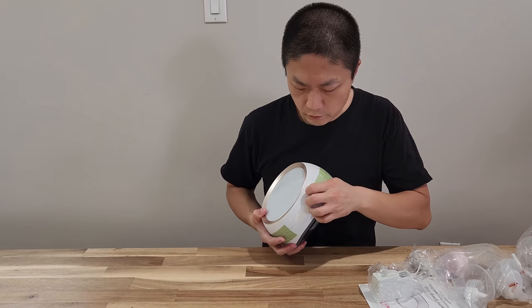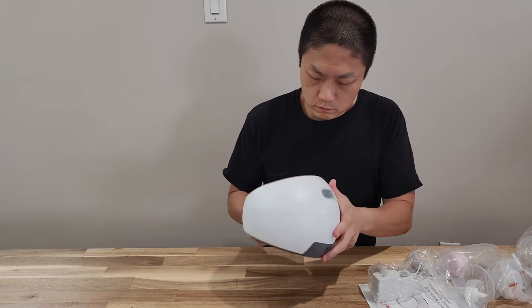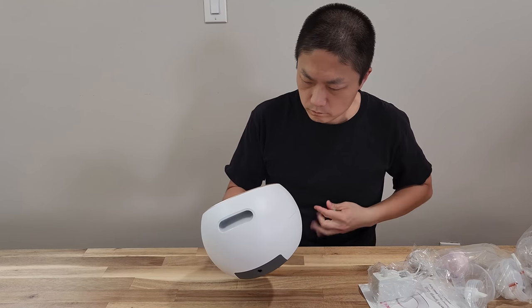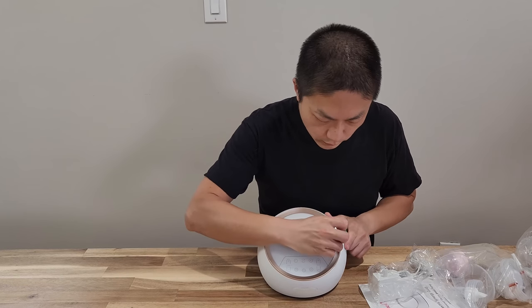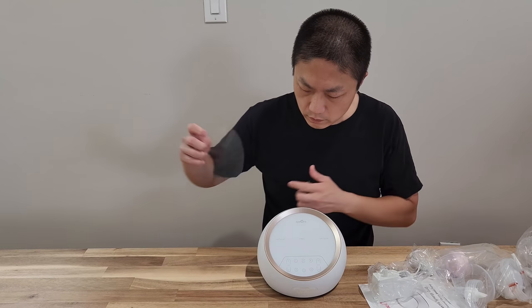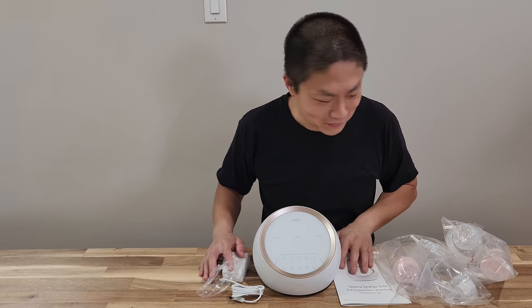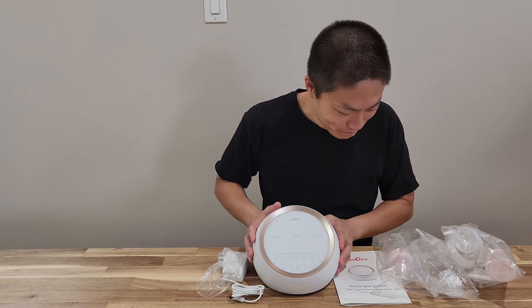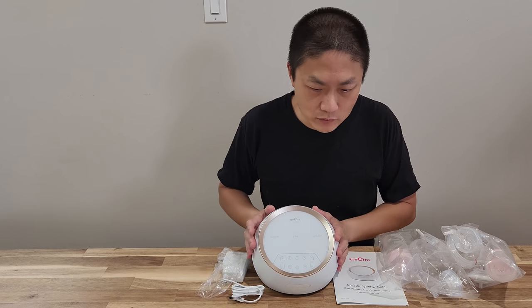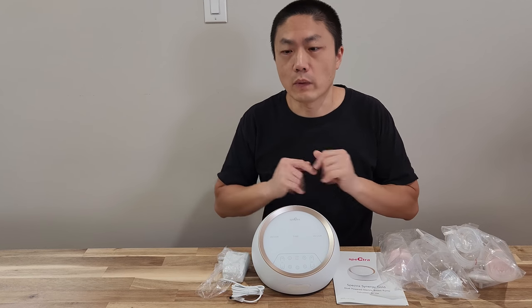It's pretty heavy. I guess this is the tape they're referring to — you need to remove it before use. There's also a layer of film on top. Usually at this point I'd say let me go try it on, but I'm just going to read the manual instruction and see how it works. Once my wife comes home with the new baby, then we're going to start using this. See you in a little bit.